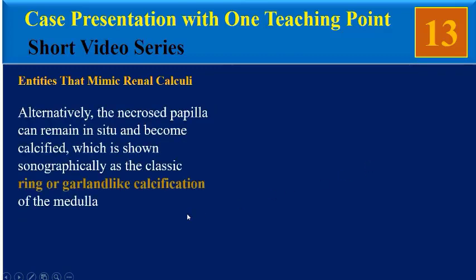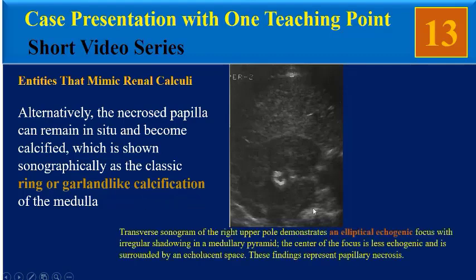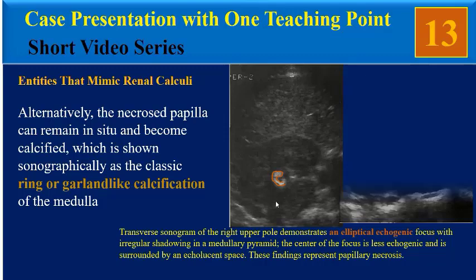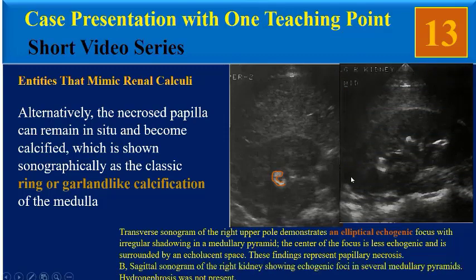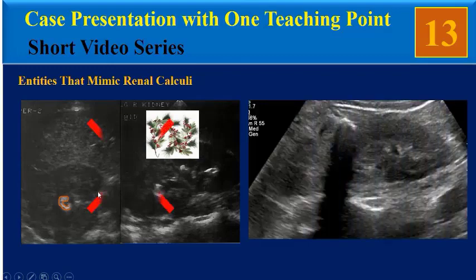Alternatively, the necrosed papilla can remain in situ and become calcified, which is shown sonographically as the classic ring or garland-like calcification of the medulla. This transverse sonogram of the right upper pole demonstrates an elliptical echogenic focus with irregular shadowing in a medullary pyramid. The center of the focus is less echogenic and is surrounded by an ecolucent space. These findings represent papillary necrosis. A sagittal image shows echogenic foci in several medullary pyramids, similar to a garland-like calcification. Our patient is not compatible with this entity.